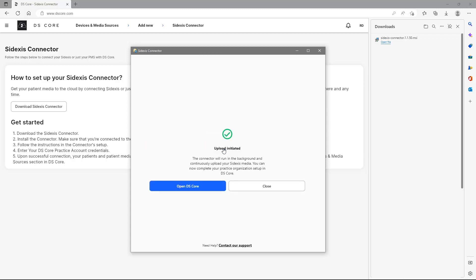The connector will run in the background and continuously upload your Sidexis media. Note that this installation and login have to be performed only once and that there could only be one Sidexis server connected to a practice account. Now, we tap on Open DS Core.